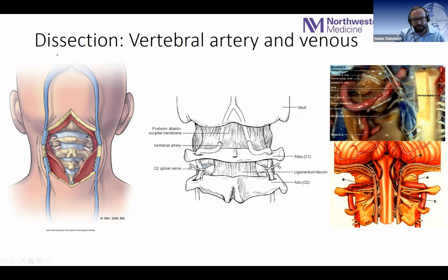And the way you know where the lateral masses are located is by exposing C2. So you can see the lateral aspect of the lateral mass, and that would direct you to where the lateral mass of C1 is, where to dip when you're dissecting down the posterior arch of C1. Because sometimes you keep going laterally and you don't want to dip there at the level of the foramina transversarium, at the level of the transverse process of C1.